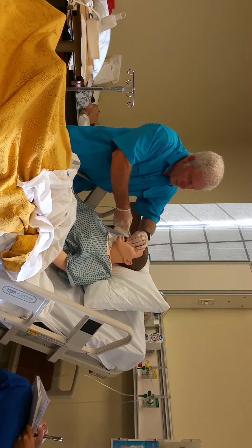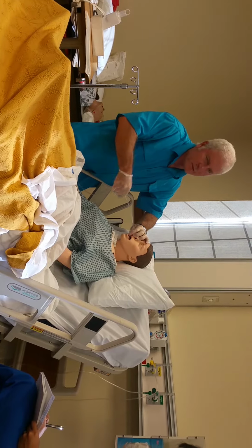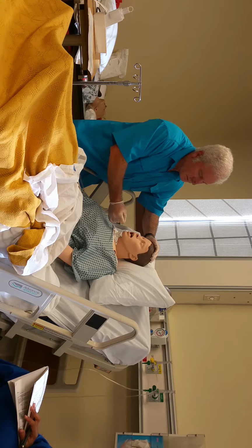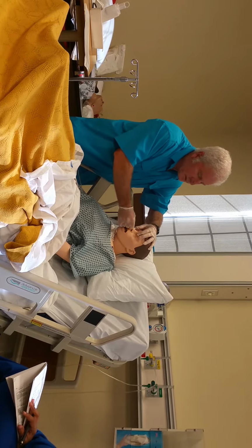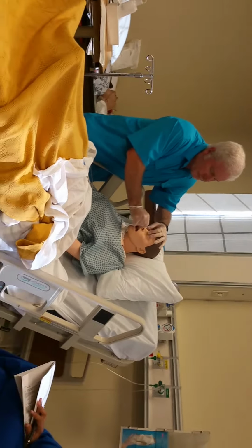Swallow. If it comes out and he gags and it comes out his mouth, it's like, okay, well, we're going to have to do this again. You pull it back to your first mark and just say, okay, we're going to do this again. Swallow. Eventually they'll get it. Oh, hey, look at that. It went. He swallowed for me. All right, good. So it went.